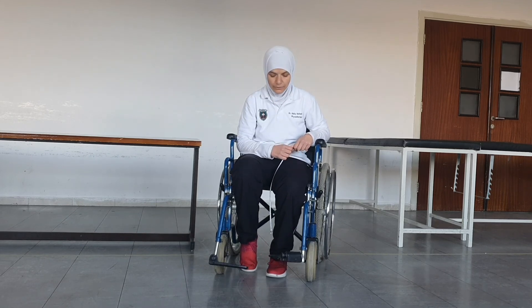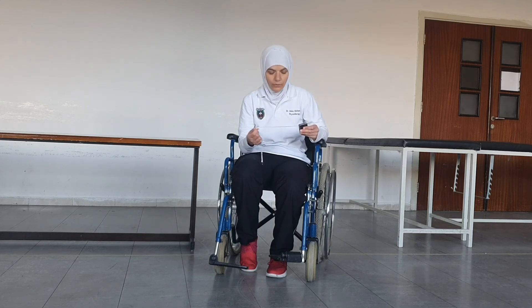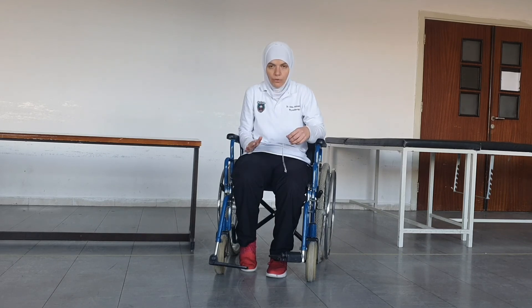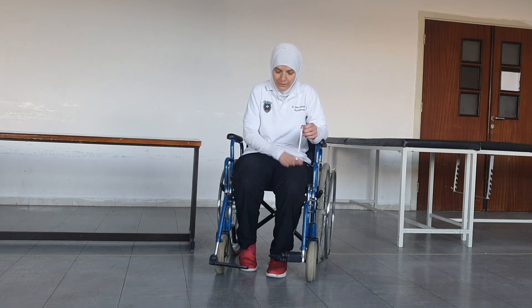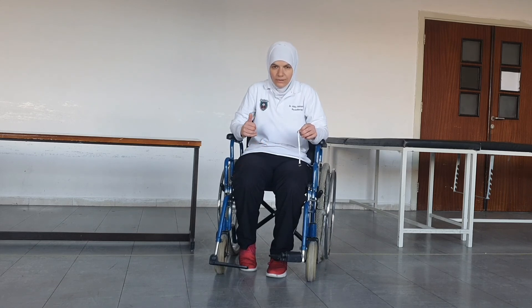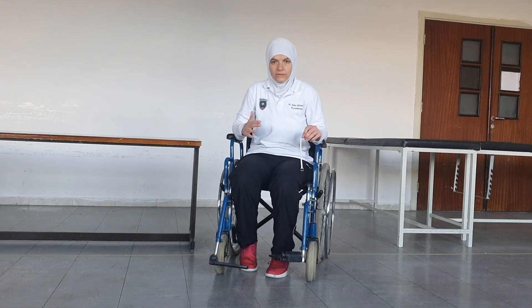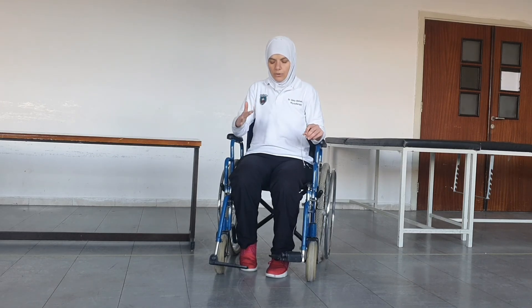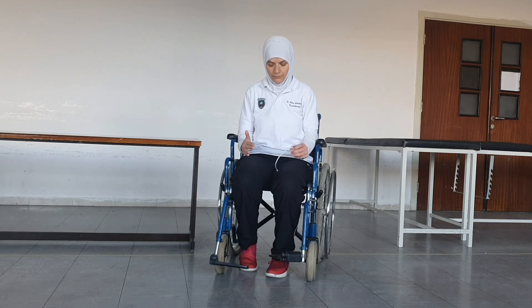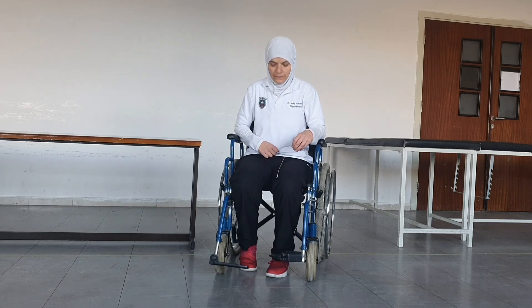These are the important measurements to consider. We should take all measurements on both the right and left sides. If there is any discrepancy between sides, this may indicate the patient is not sitting upright or symmetrically. In that case, we need to correct the patient's sitting posture before retaking the measurements.